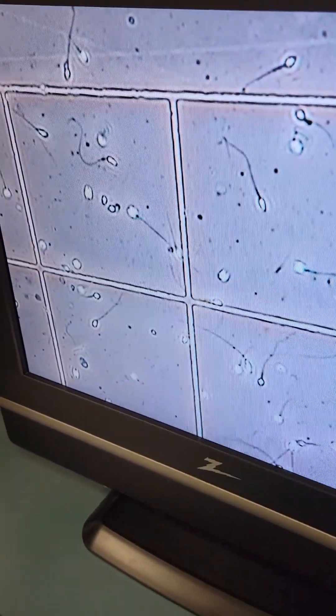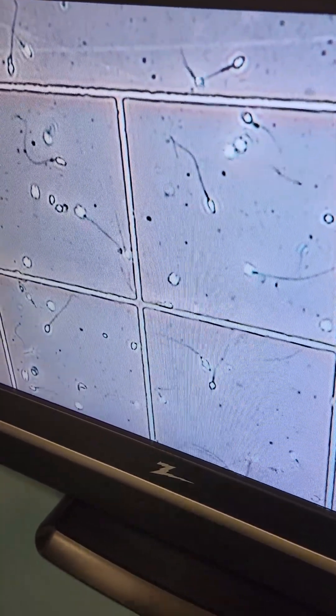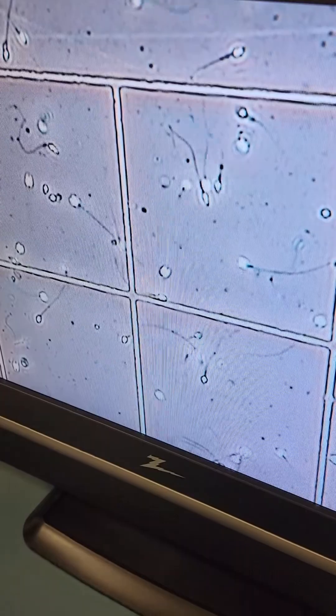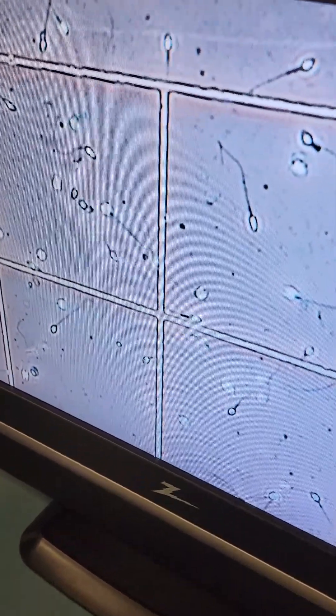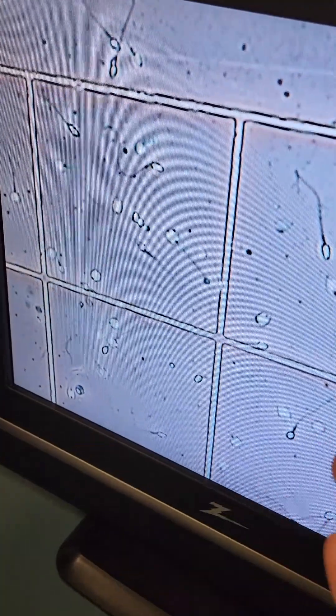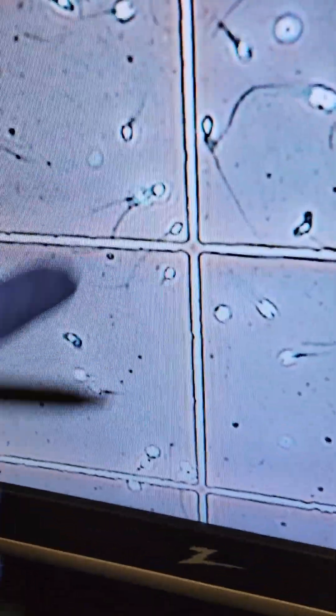The health of your sperm is based on a few things. One of them is motility — we look at the speed that your sperm is moving at, and whether they're going in a direction. What you see here would be considered a normal sample; most of the sperm are moving and clearly moving in a direction. It's perfectly normal to have some sperm with lower motility, and this is an example of what that looks like.